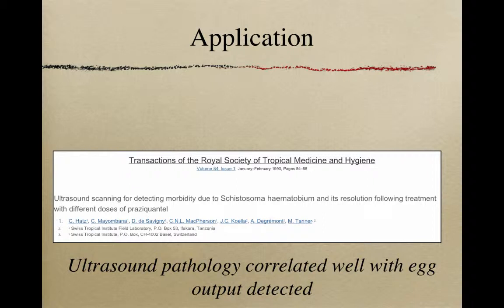So just as a refresher, the three things we're going to be looking at are the bladder, looking for signs of irregularities or thickening of the bladder wall, and then evaluating the kidney, looking for hydronephrosis, and looking for any signs of the ureter being dilated.